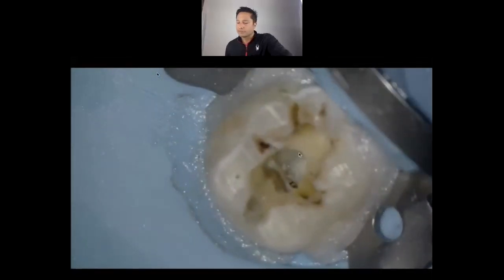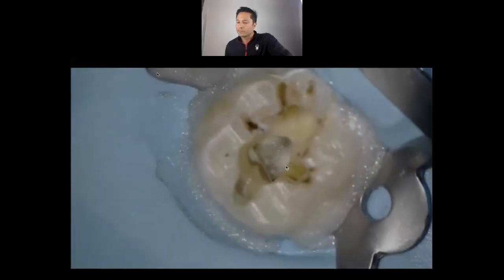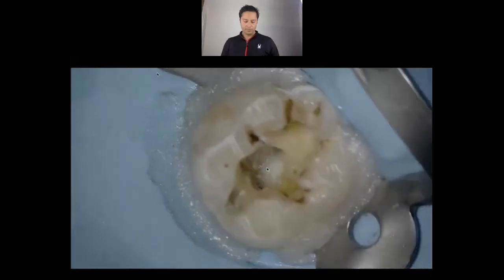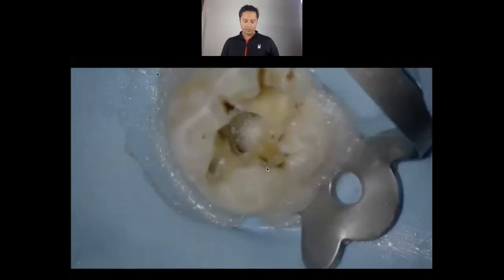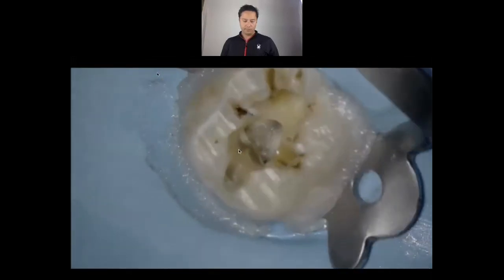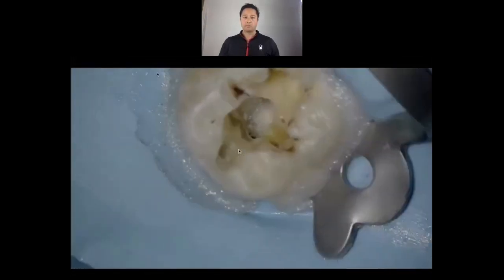The law of symmetry: we've got this dark developmental groove down the midline. The mesial buccal is equidistant from the midline — this orifice is the same distance from the midline as this orifice. And in the distal, there's our one orifice right there. As we clean and shape more, you might actually find another canal pop up. So that's it for our mandibular molar access — place some comments and let me know if this was helpful.